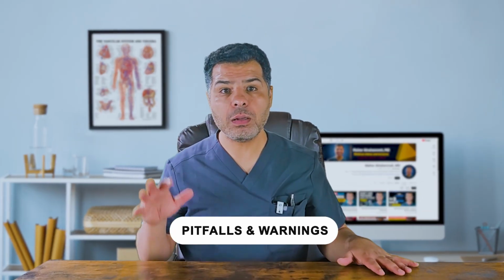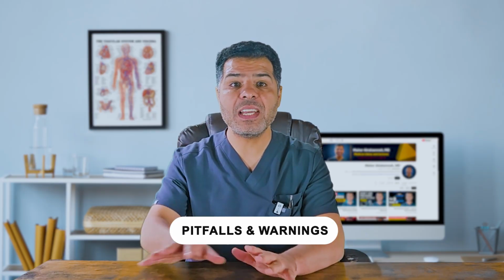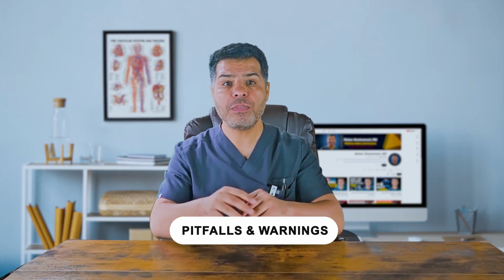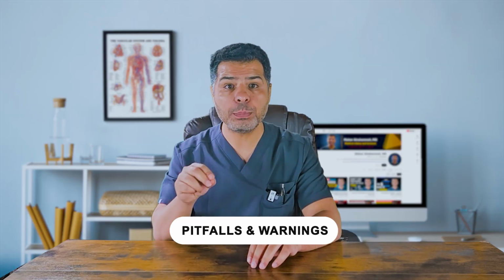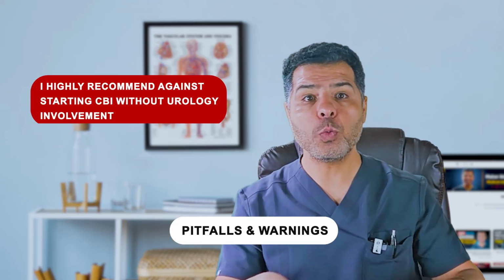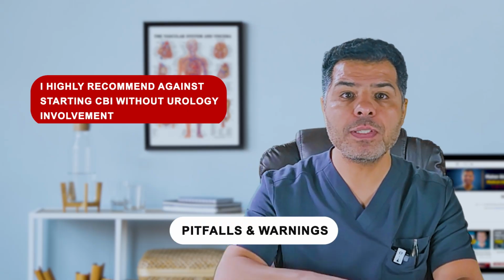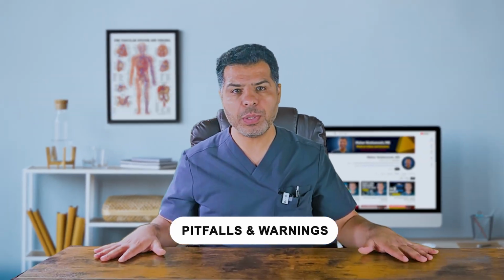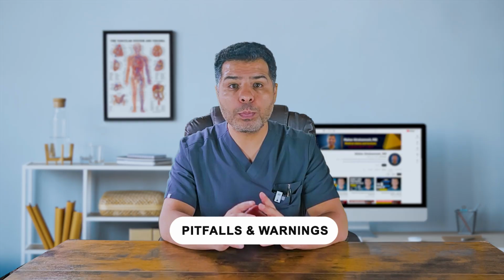Hematuria with clots can clog standard Foleys. If a patient has significant bleeding or hematuria, use a large 3-way catheter with continuous bladder irrigation to prevent clot obstruction. And remember this: if you decide to do that, please consult urology. I highly recommend against starting CBI without urology involvement. If no urology is available, then transfer to a facility with a urology service before starting CBI or as soon as you start CBI.